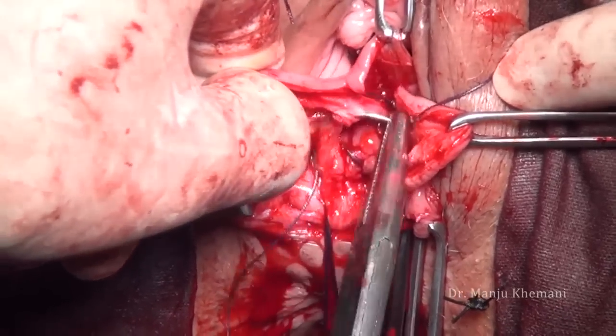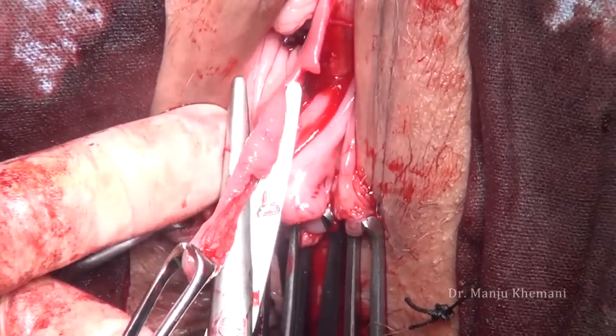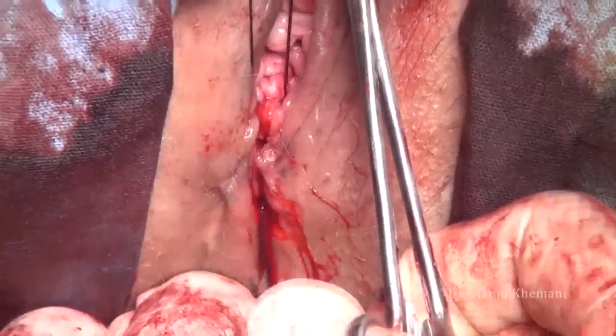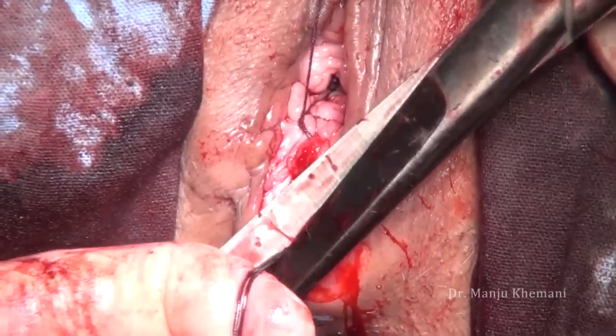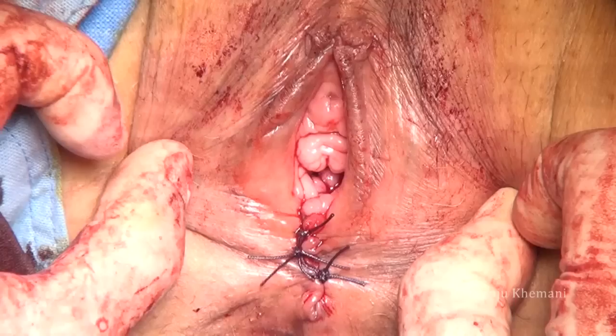Once you've closed the fascia, the rectovaginal fascia on both sides is plicated. Redundant vagina is cut. Before suturing the vagina, the levator ani sutures are tied. The vagina is closed with a locking suture. This is the end result — just two more sutures have to be put in the skin.